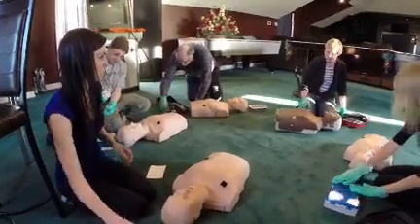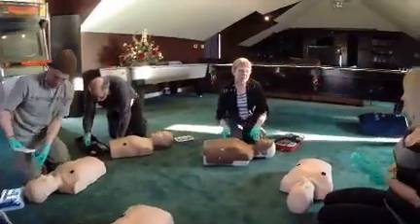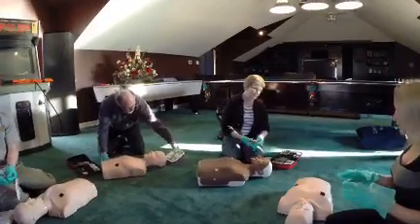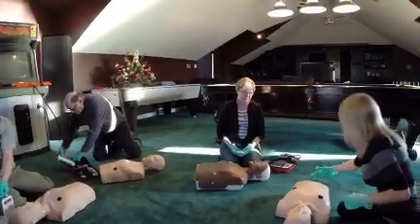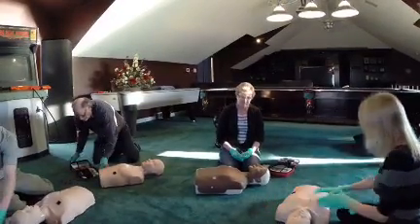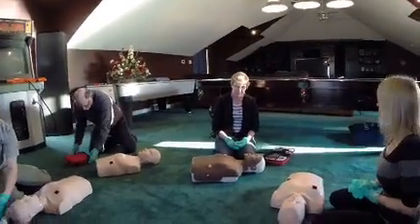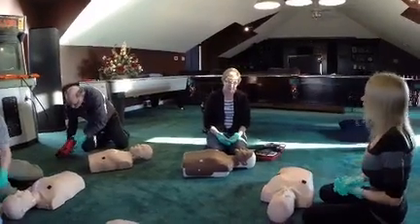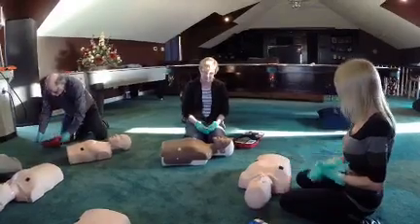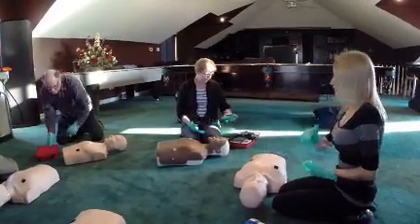So how would you remove the shirt from your casualty? Well, in your AED package, there will be a little bag with some scissors, and you're just going to cut that whole shirt right off and open it up, because you need to make sure you can see their bare chest, in case there's any patch medication, or you're going to look for that pacemaker, maybe if you have one. So yeah, just cut it right off.